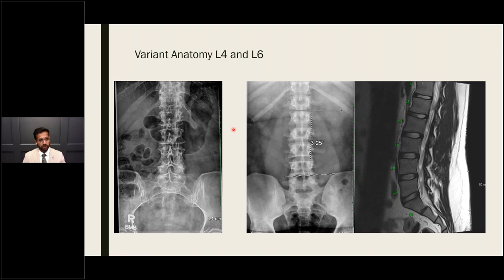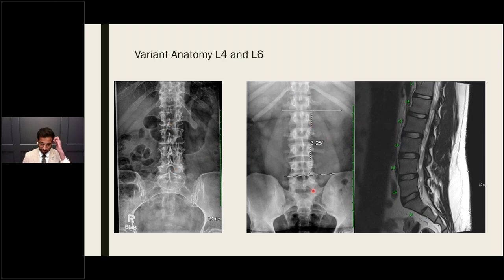Variant anatomy can include patients with four lumbar vertebral bodies or six. It is always important to compare to MRI and count spinal levels appropriately.